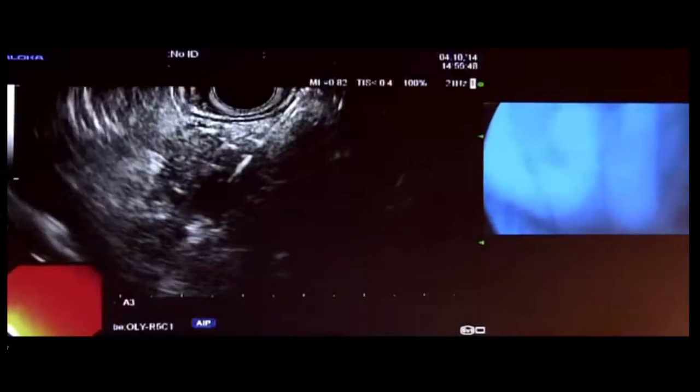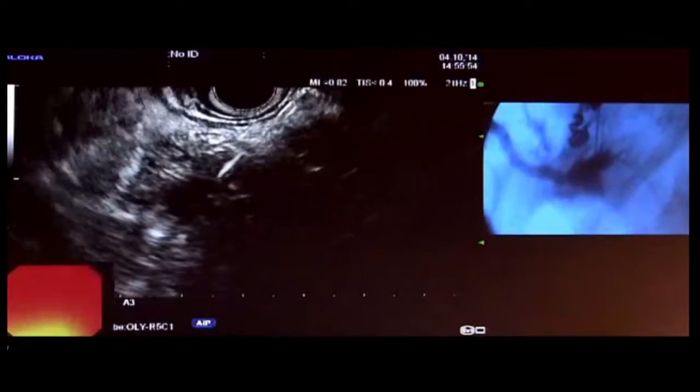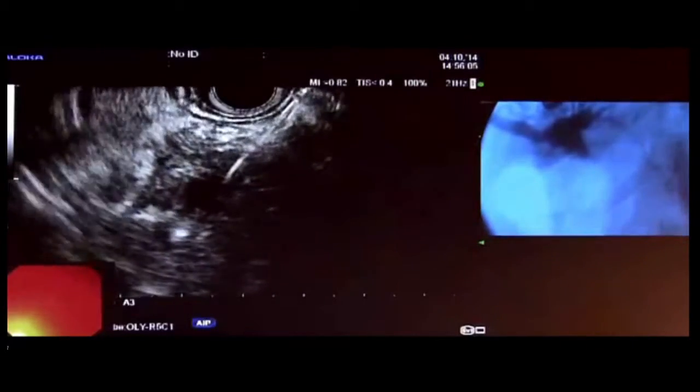Other way? Other way. Good. Okay. And maybe a little bit more over, so we want to see more of the right side. No, other way, yeah, other way, sorry, there you go. Okay, that's good. So let's try again with the wire. Because that's where the obstruction is.